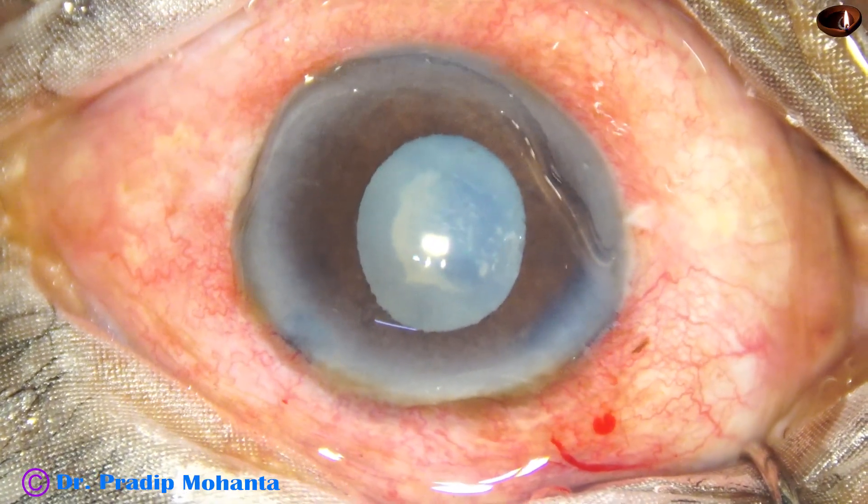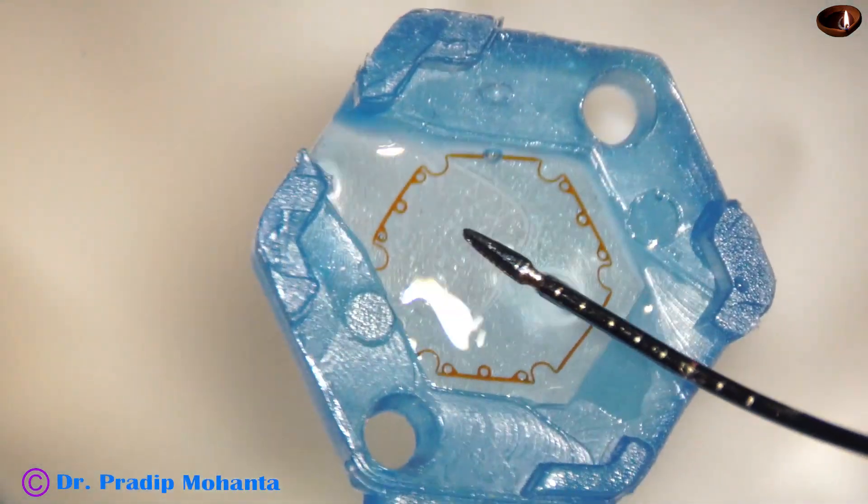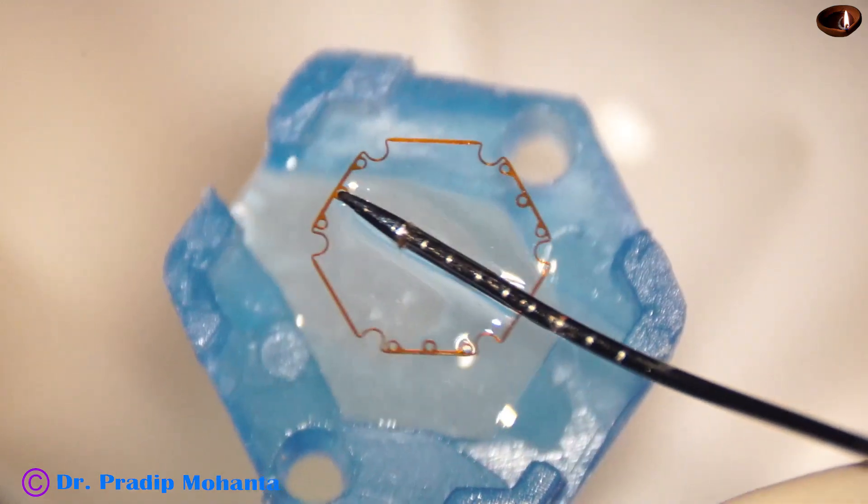B-hex is a pupil expansion device invented by my friend Dr. Sivan Bhattacharji of Kolkata, India. This is the device.